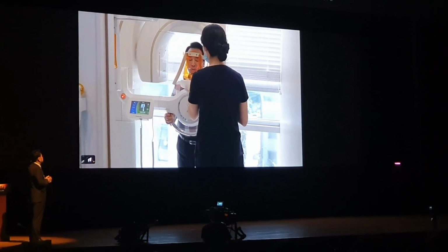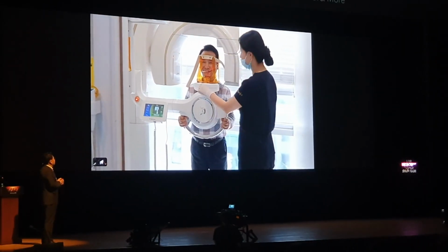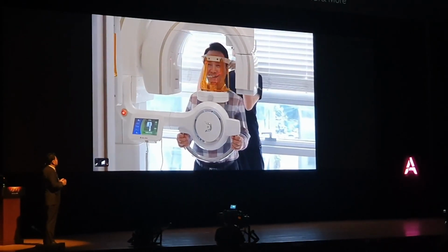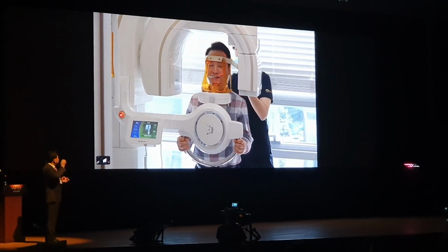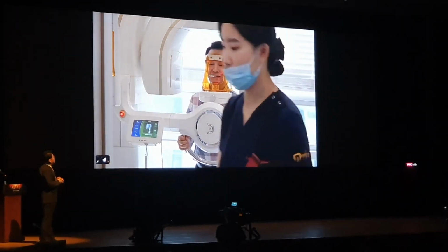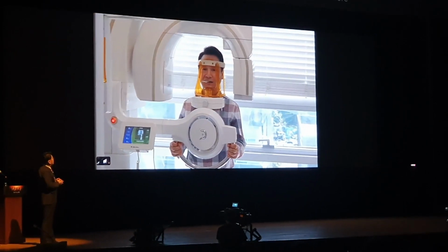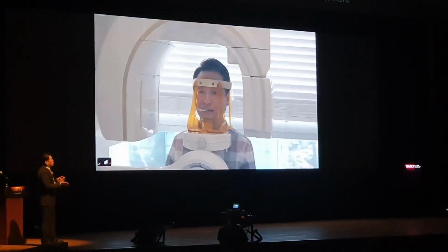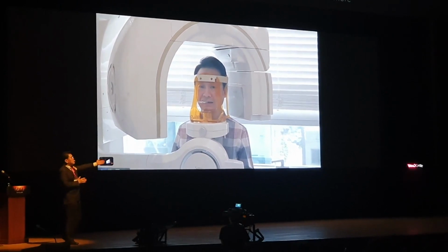Please go ahead. Actually, I asked Dr. Ho if he extracted number 16 for today, but he said he wasn't. Normally, it takes a while for the CT scan data to be saved, but if it's linked to the VARO guide software, the data comes through immediately, automatically. So I assume it'll take about 2 minutes from now. CT scanning, then reconstruction, and then save, it'll take about that much time.